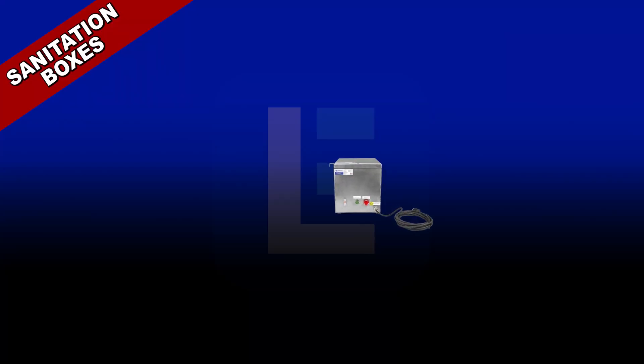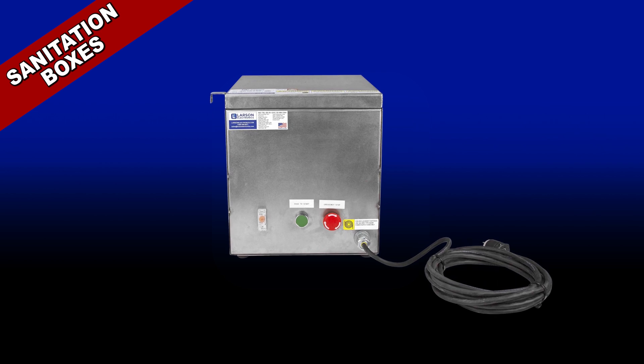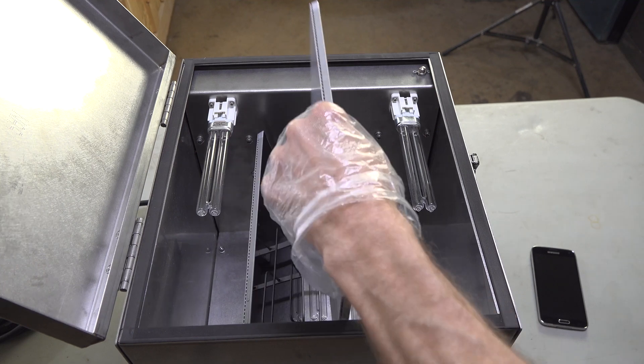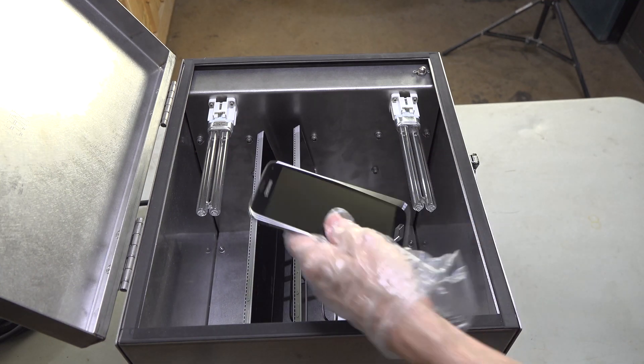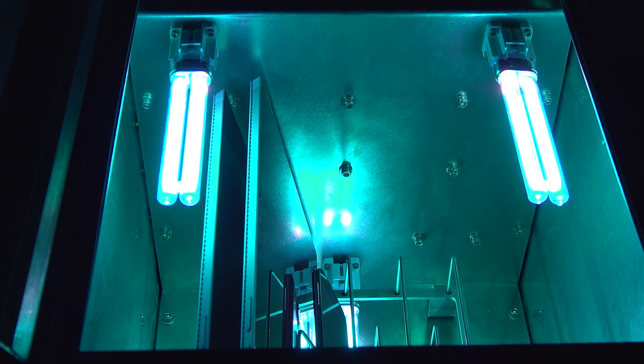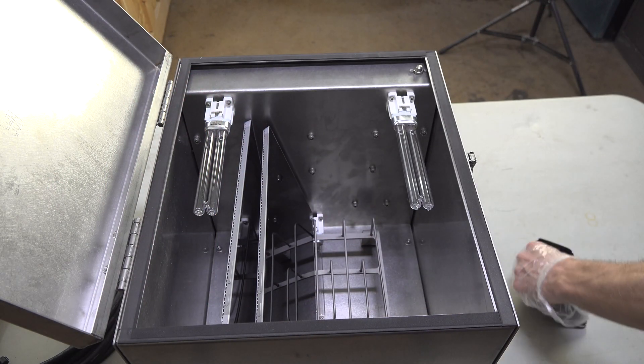UV disinfection boxes. These devices are recommended for disinfecting compact tools and equipment on tables, desks, workstations, and surfaces. Individuals may leave their electronics and personal devices inside the box. After exposure, the devices can be used again immediately.